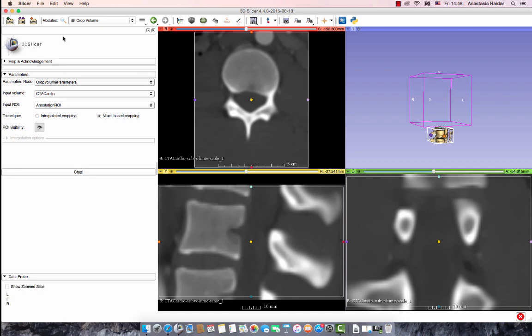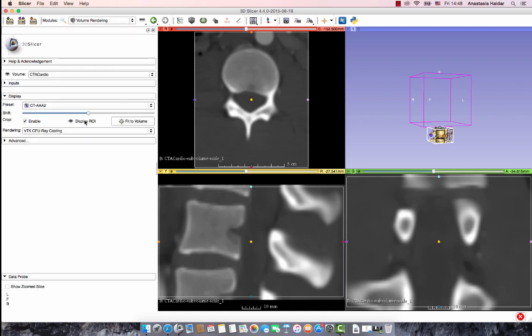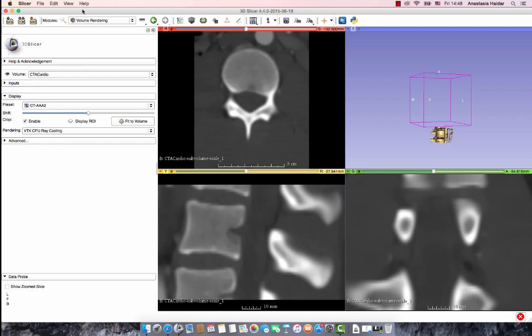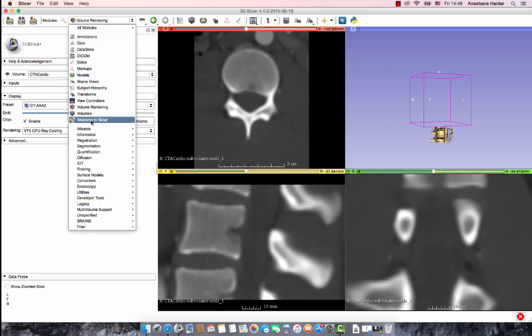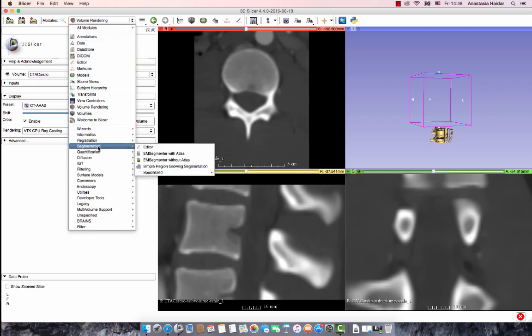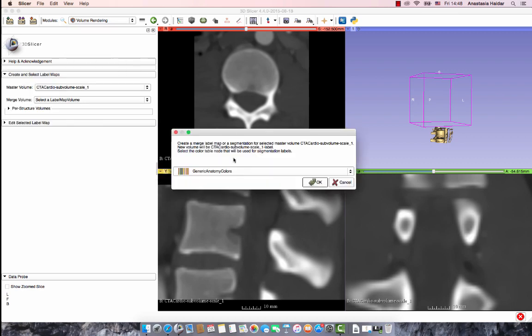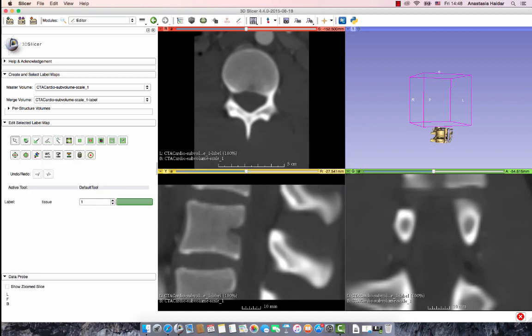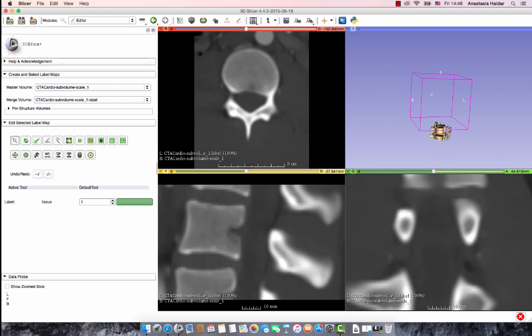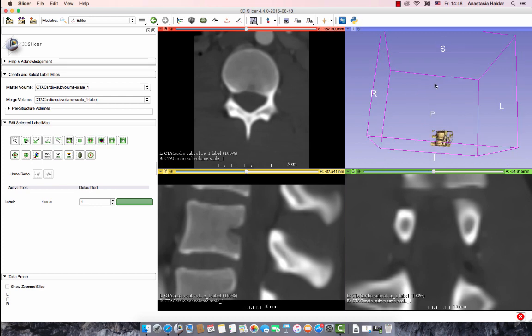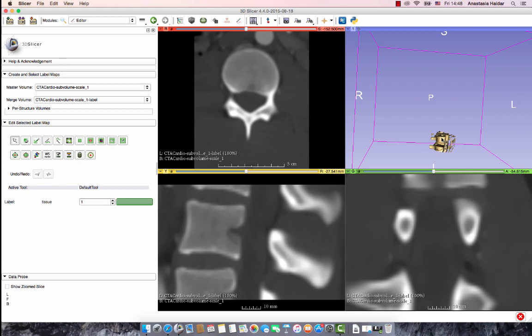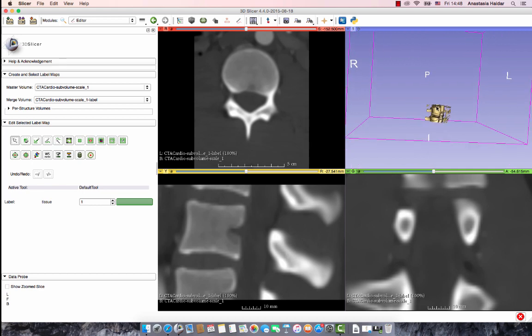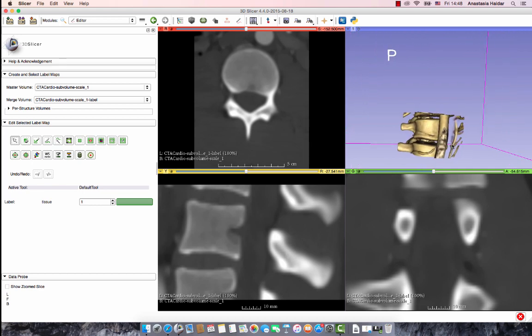You can then go back to the Volume Rendering module to get rid of the ROI box. Next, go to the Segmentation module and choose Editor. This is the main module which allows you to manually segment the data you have chosen. In the 3D Viewer, click on the rightmost selection to center the 3D view of the scene. Zoom in and middle click to drag the structure to the center.